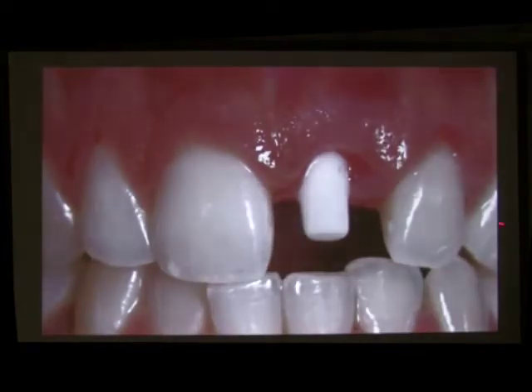And this is just with bone graft, no gum graft. So the gum level is actually lower than the natural dentition. When we see, if we place any type of temporary solution, the gum never comes down. Plaque retention and gum growth are not compatible.